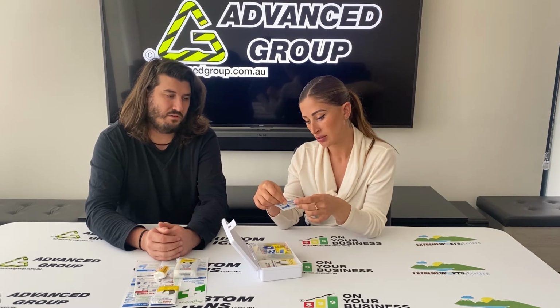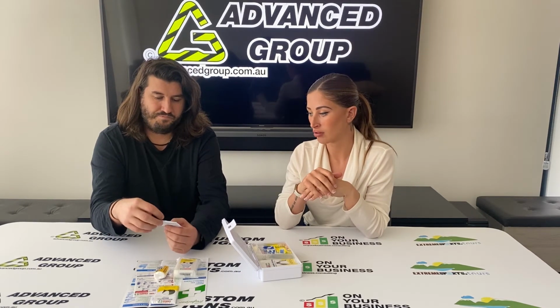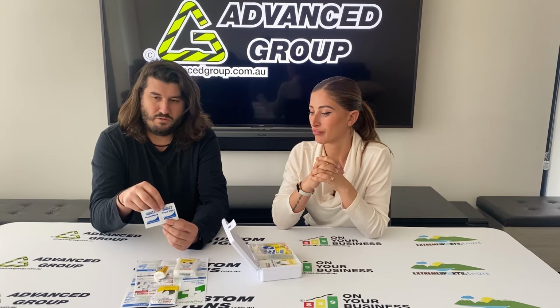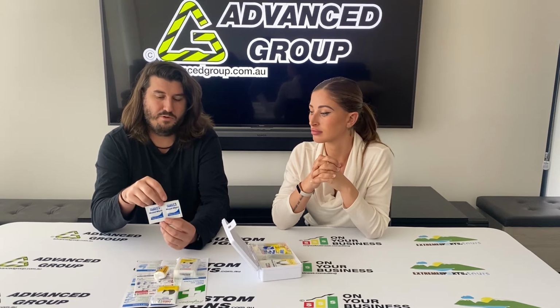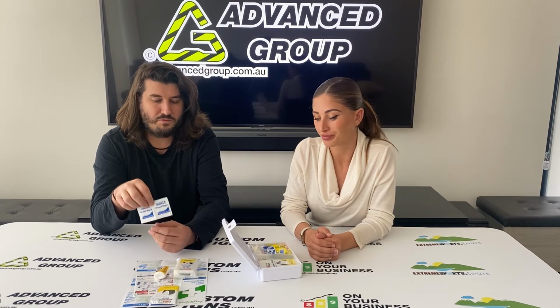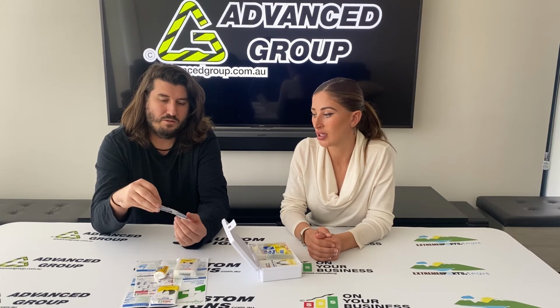Mm-hmm. Yeah. And wound wipes, is this like alcohol or something? Yeah. So sterile alcohol wound wipes. So you'd wipe a scar or scratch or something like that with that first. People sometimes will have dirt or gravel or some sort of harmful thing mixed in with their open wound. So it's important to not just bandage up a dirty, dirt-infested or some sort of contaminated wound, and then put a bandage around it because that could fester. So alcohol wipes, very important.